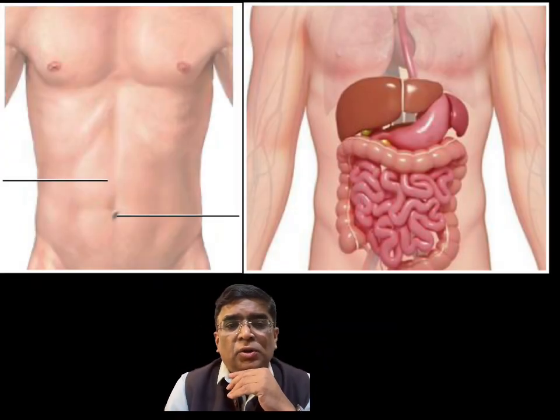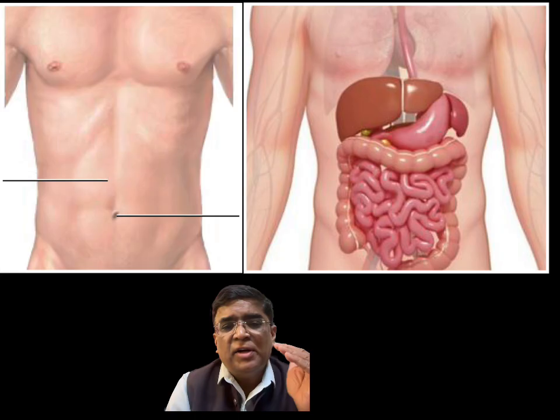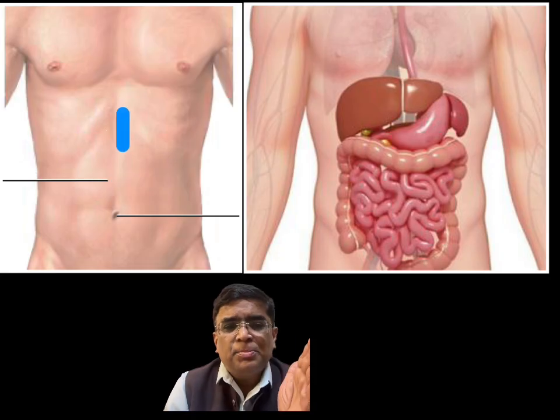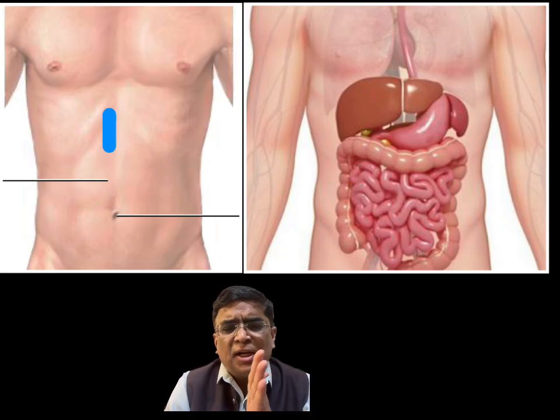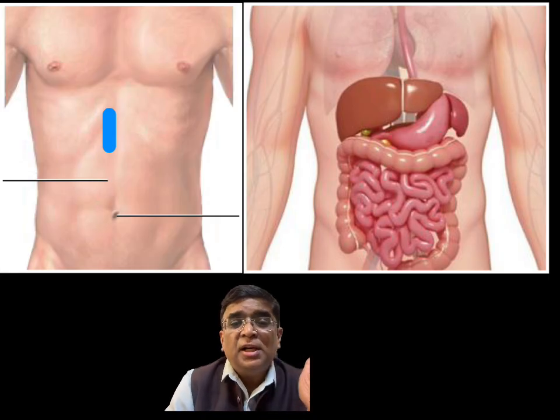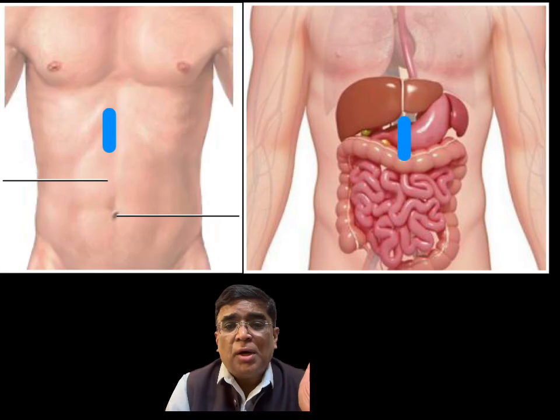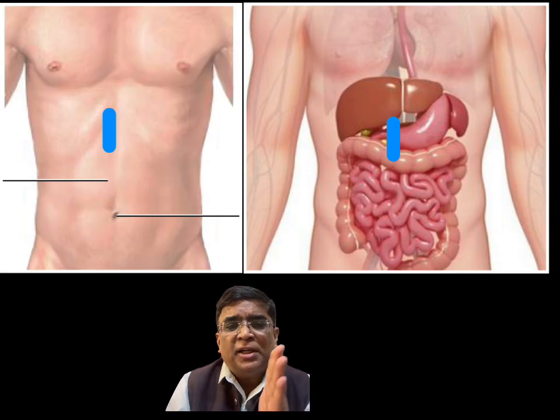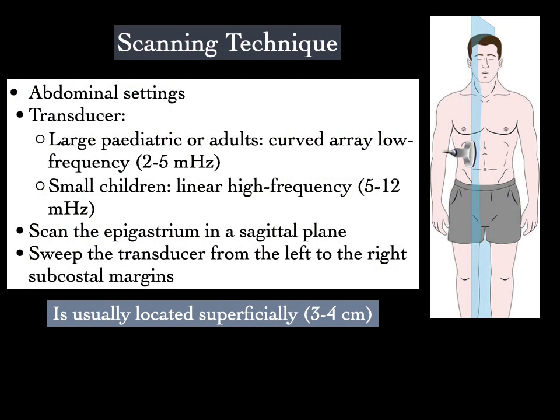Essentially, what we do when we do gastric ultrasound on a patient who is lying flat is identify the space just below the xiphisternum, start slightly to the left of the median and slowly move towards the right. Till when? Till we cross the aorta. I will show you how now. So this is what is happening. It moves from slightly to the left, to the right, and that is where we identify the gastric antrum.